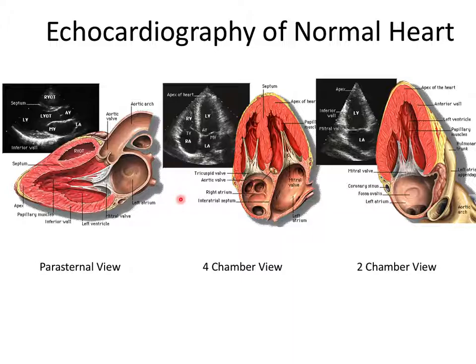And then you move the transducer down away to below the ribs and look up towards the heart from the apex of the heart to get the left ventricle, the right atrium, and left atrium all in one view. So that's cutting right through the center of the heart. And that is called the four-chamber view for obvious reasons. Here's the myocardium and the atria.